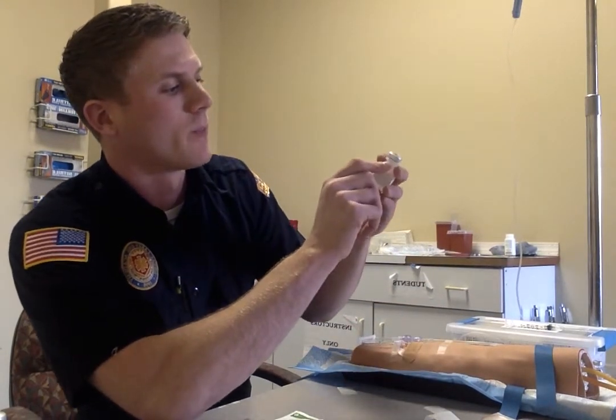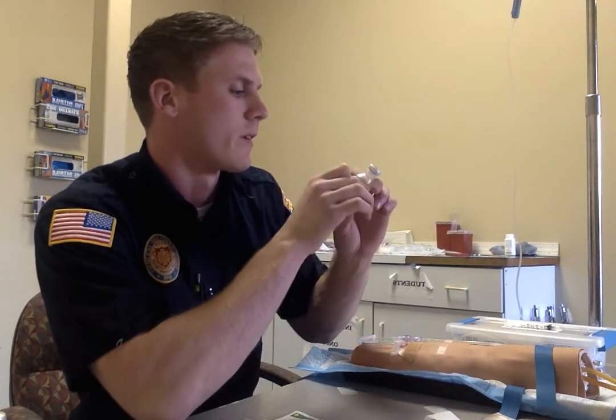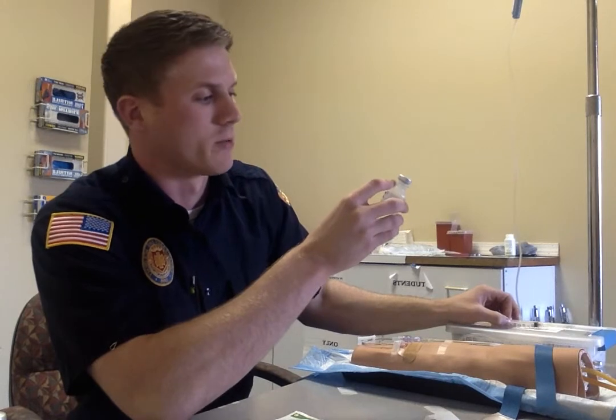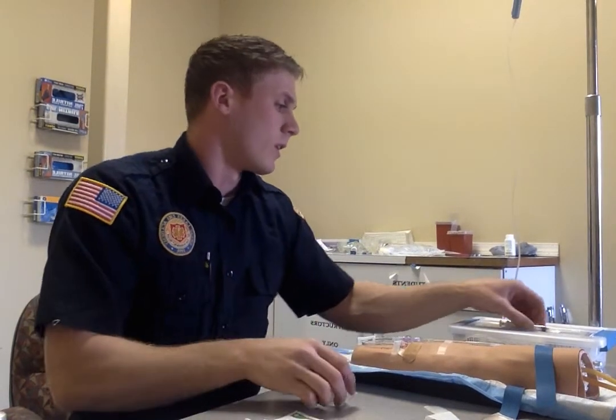We have our amiodarone here, which is 150 mg in 3 mL. Expiration of 9 of 18, so we're all set there. I'll get my second check from my partner, and then I can check again. Amiodarone 150 mg in 3 mL, so I'll be drawing up 3 mL — so here we've got our 3 checks.